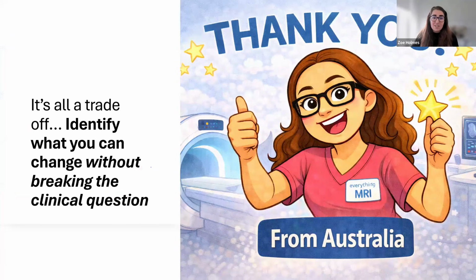So thank you, everyone. My final sentence from this is MR optimization is about identifying what you can change without breaking the clinical question. That is always the premise of modifying things. So always start with what the question is. What pathology are we trying to see?